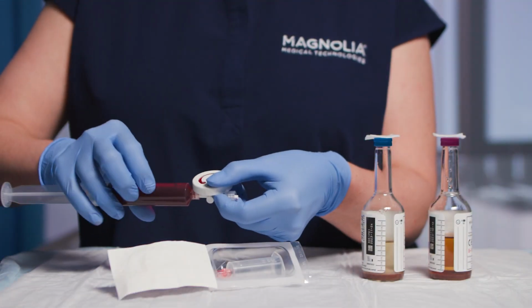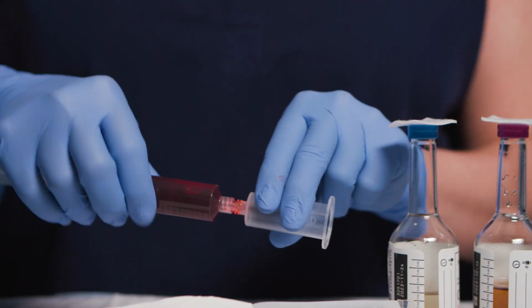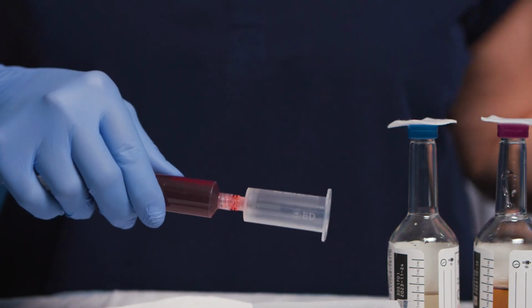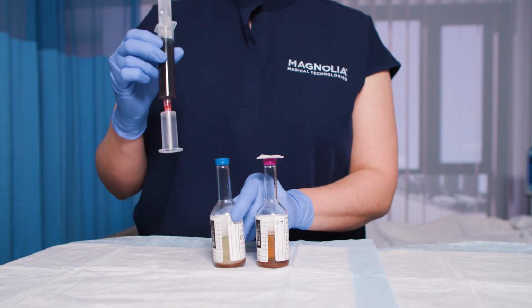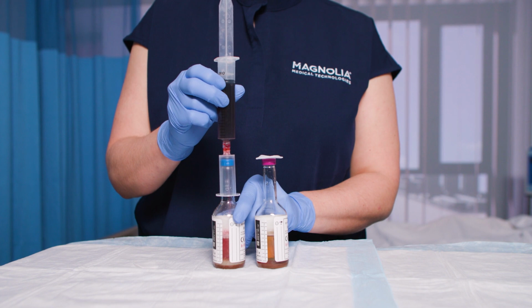Using aseptic technique, disconnect syringe from Steripath Micro. Immediately attach blood transfer device to avoid touchpoint contamination. Transfer blood from syringe to the bottle using bottle's vacuum. Do not depress plunger of syringe.